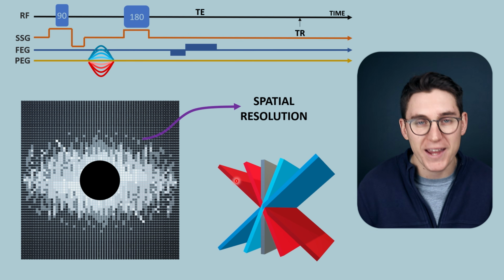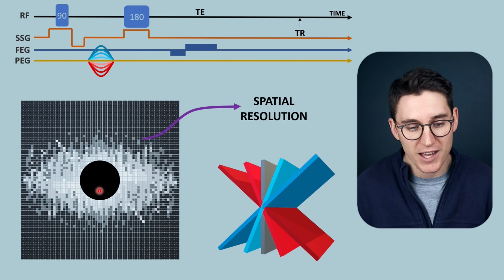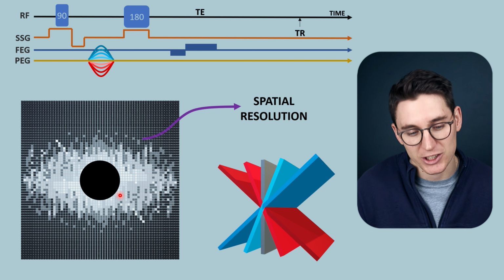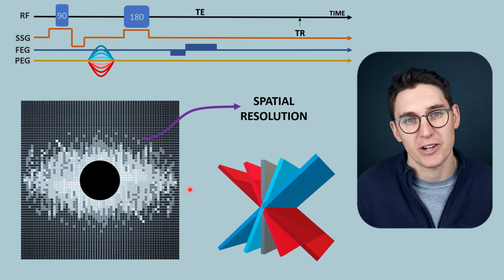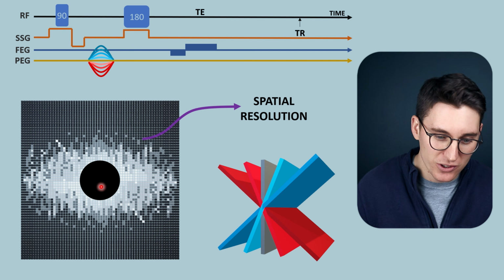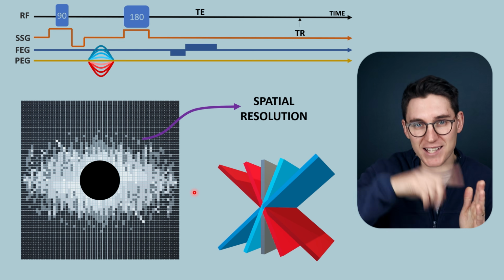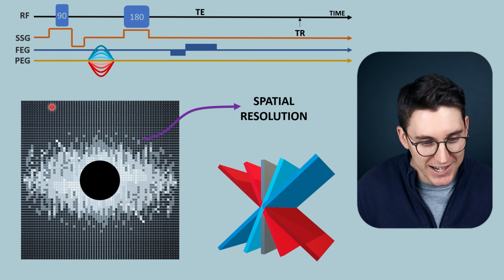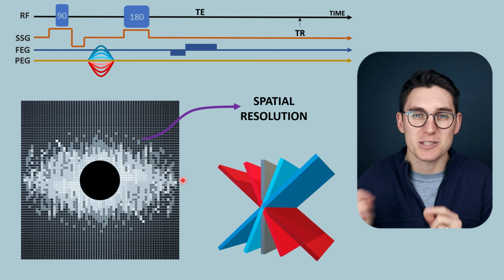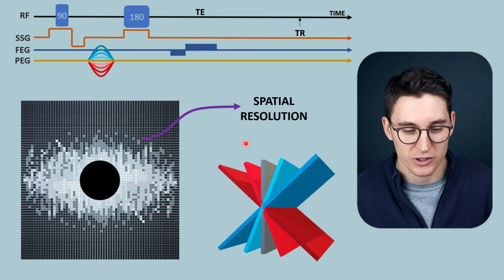amplitude, or the main signal, is coming from the center of K-space, and that gives us contrast. The rate of change of dephasing in both the phase encoding direction and the frequency encoding direction can be plotted as a waveform, and as we head out to the peripheries of K-space, that waveform gets shorter wavelengths and higher frequencies. This data represents higher frequency data and ultimately gives us better spatial resolution within our image, allows us to see edges between tissue boundaries.